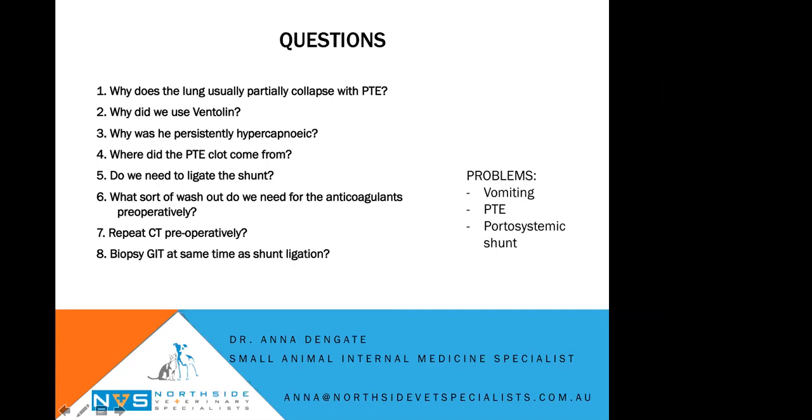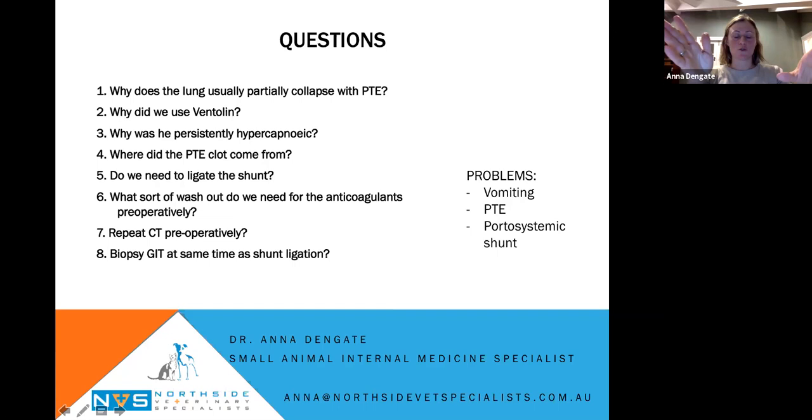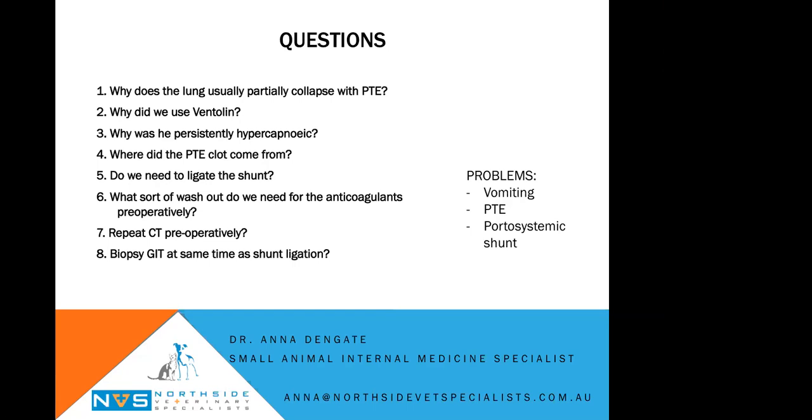Sorry, I meant to say, you know, the blood diverts through the shunt. Yeah. And I'm not sure whether I'm going to get the terminology right here, but the section of gastric vein distal to the shunt. Is it distal or proximal? Probably say away towards the cava or towards the portal vein. Yes.